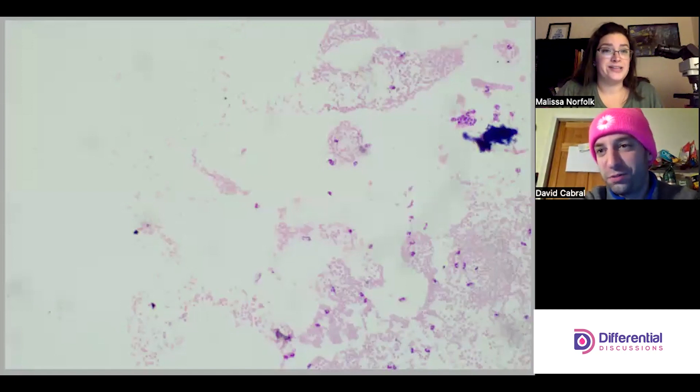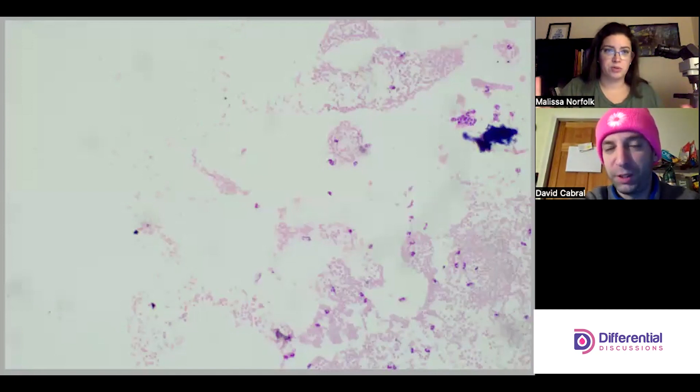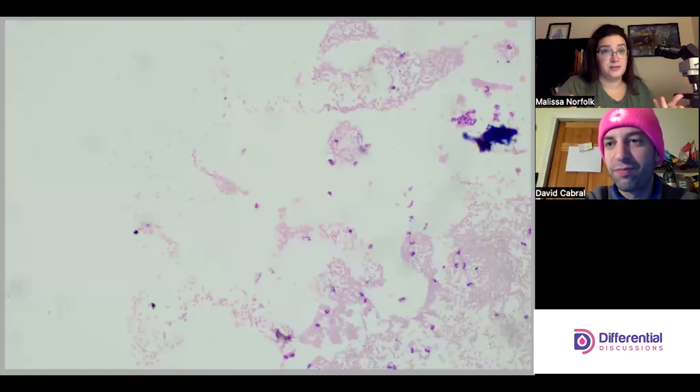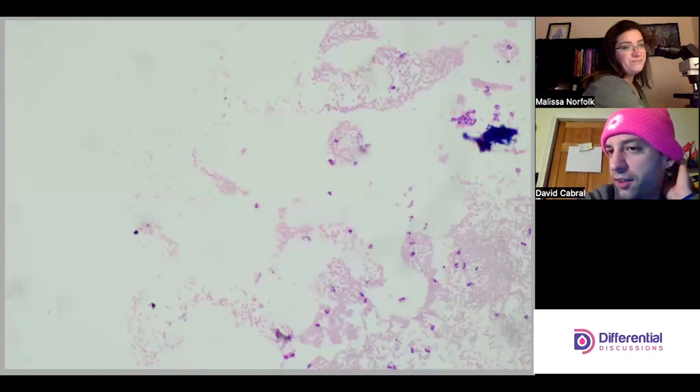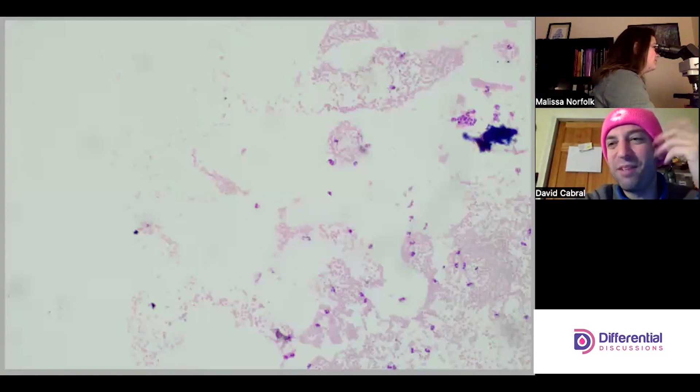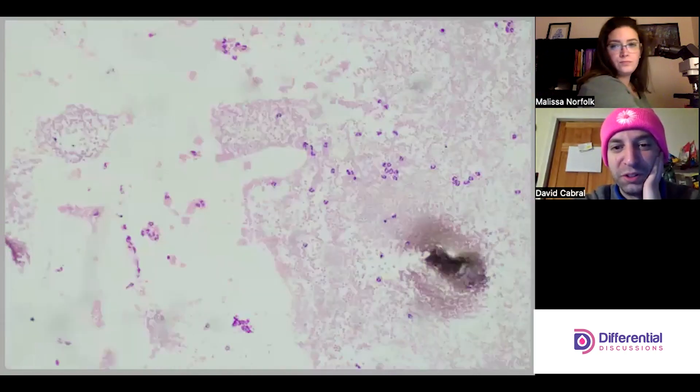Even though we're on 10x, it's important to point out we're not going to assess any red cell morphology. The blood will just make the sample more cellular, but we're not going to say anything about red cells. Calling morphology on a cytocentrifuge red cell is not a good idea, and it's not representative of what's happening in peripheral circulation.